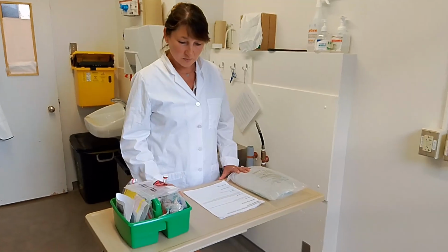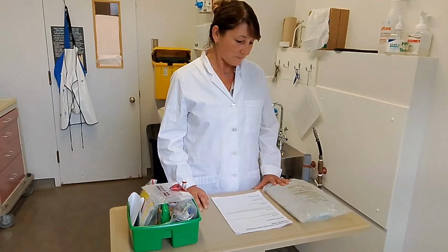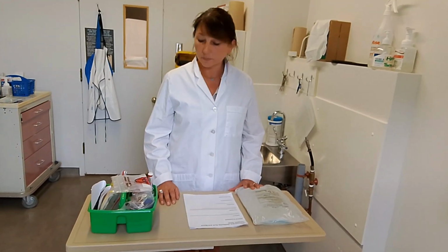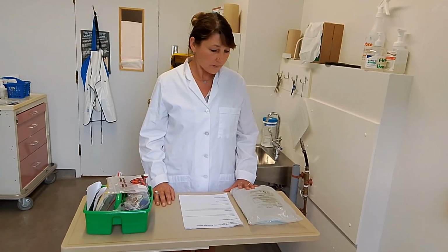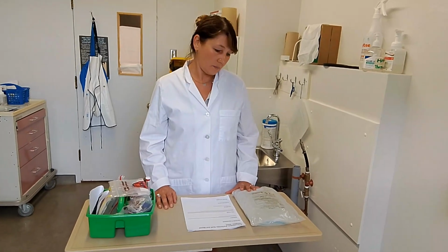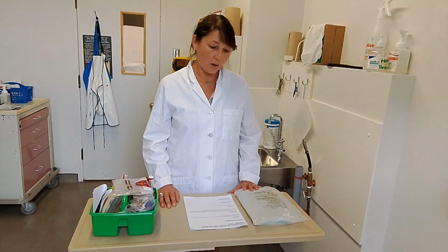Clean the surface to be used to procure the samples. Wash your hands according to the hospital policy, and proceed with the patient's assessment. Assessment will include taking vital signs, taking temperature. If the patient has a fever, make sure that the blood cultures have been done earlier, and also start draining. Proceed with the manual exchange to obtain the fluid to procure the samples.